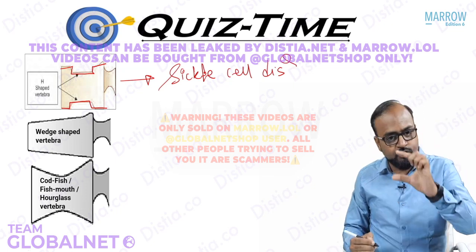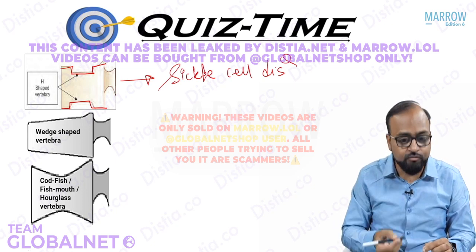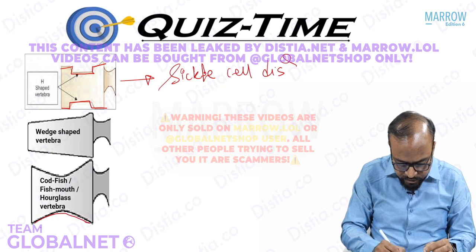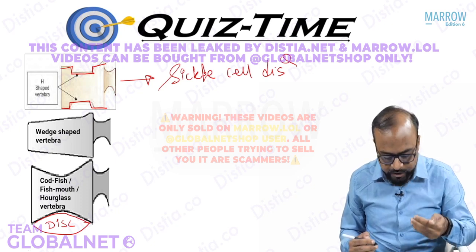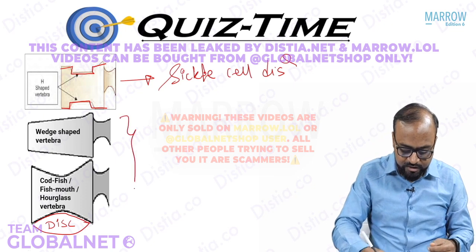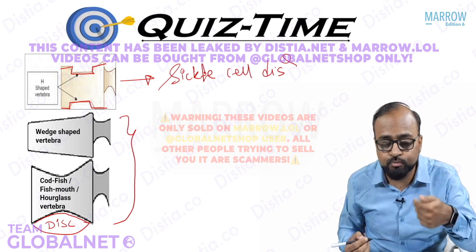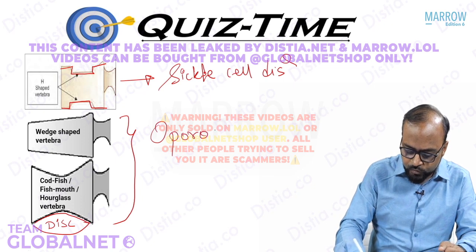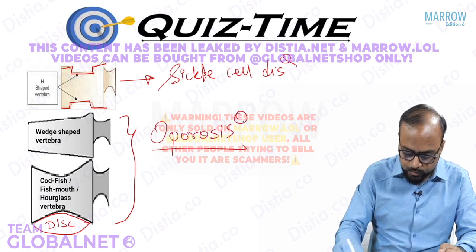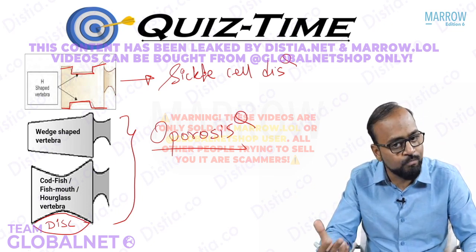A wedge-shaped vertebra, so a partial wedge collapse of a vertebra, or when the bone is weak, when the bone is softened, what happens? The disc itself creates an impression on the vertebral body. This is called a codfish vertebra or a fish mouth vertebra or hourglass vertebra. As you've guessed, it happens when the bone density is significantly decreased, as happens in elderly postmenopausal women. So these are features of what? These are features of osteoporosis. So wedging of the vertebra, codfish vertebra, fish mouth vertebra, they are all features of osteoporosis.